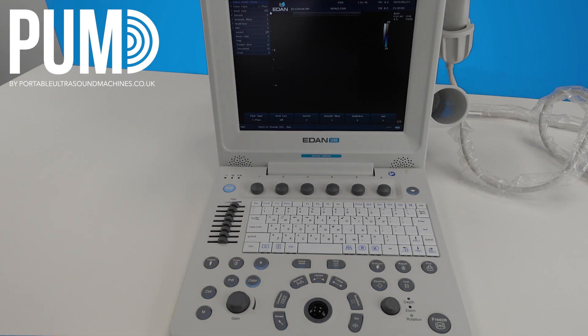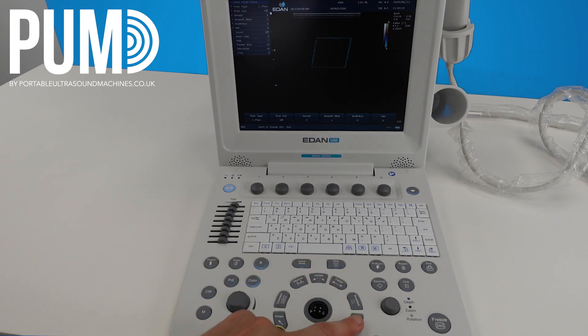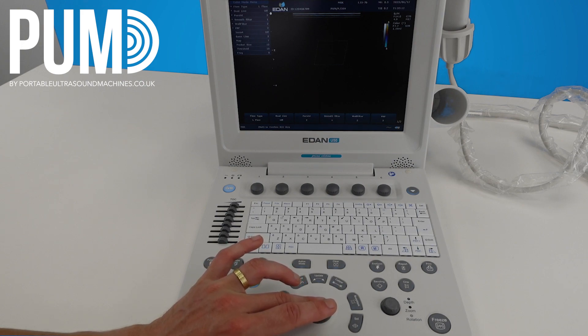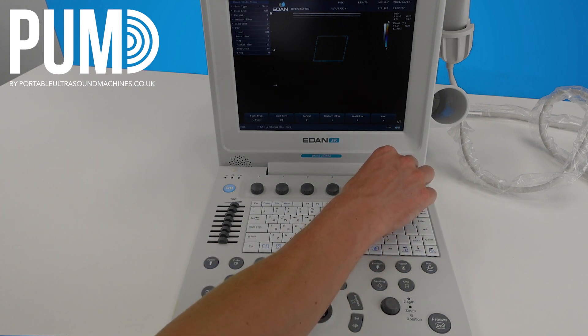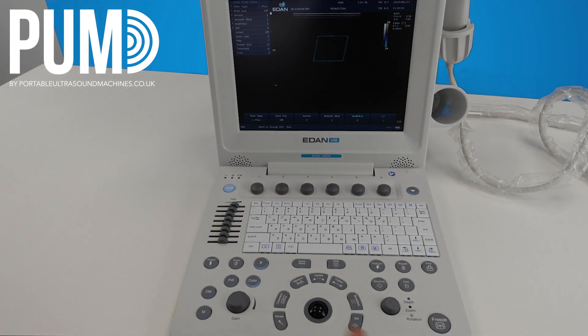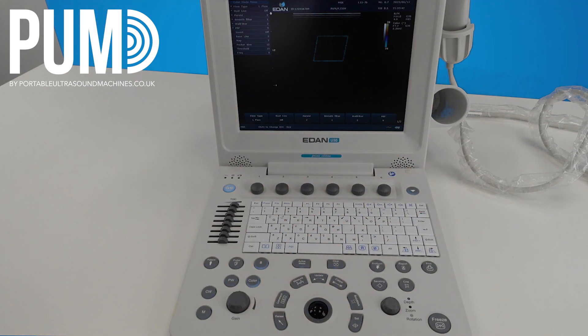I can put a color box on — this will bring up our color box. Use the trackball to adjust the position, hit set, then use the trackball to adjust the size, and then set again to readjust the position. One thing I would note with the color is that on a lot of the presets it starts with a very low scale. With this low scale you'll get a lot of color bleeding and artifact. So just adjust the PRF to increase that scale a little bit depending on what flow you're looking at. Obviously if you are looking at very low flow you might want to reduce the scale, but a lot of the time you'll just need to increase it a little bit. Once you've done all your color and you're happy, you can hit B and that will always take you back to your 2D image.